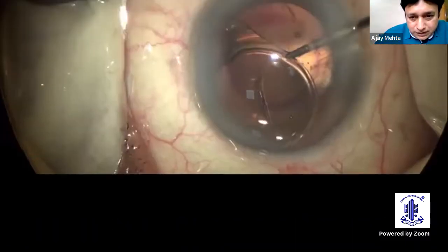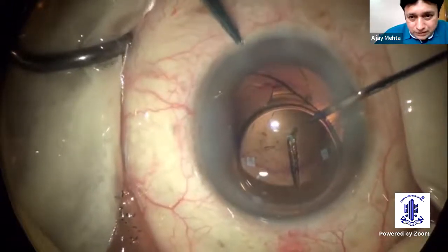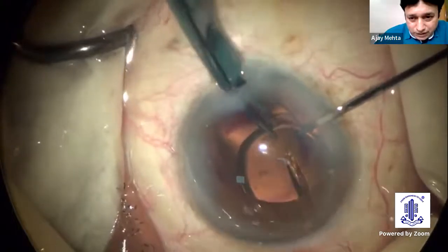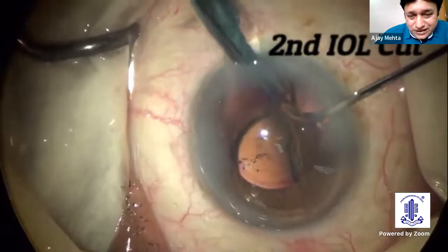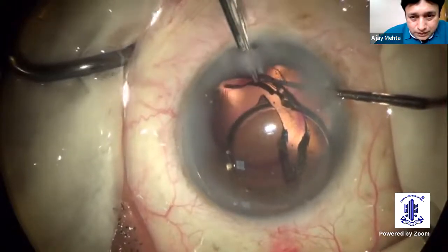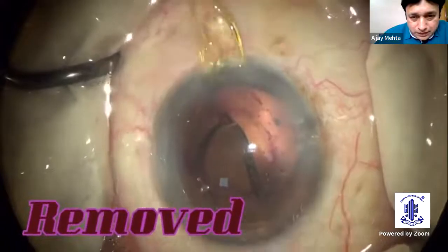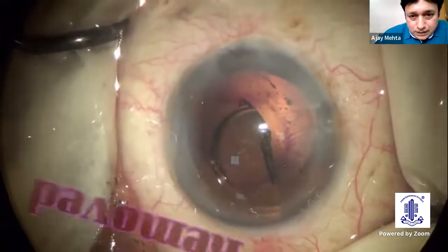And surprise, here the leading loop was missing. So again I cut the lens in two, as now I was an experienced surgeon in cutting lenses, and with this I could easily remove it through the same size incision. And of course, all the while I was protecting the endothelium.